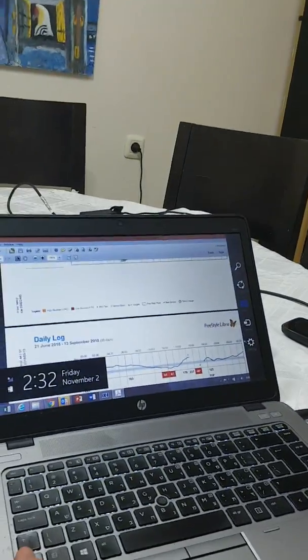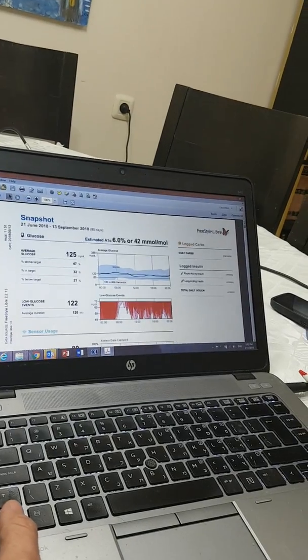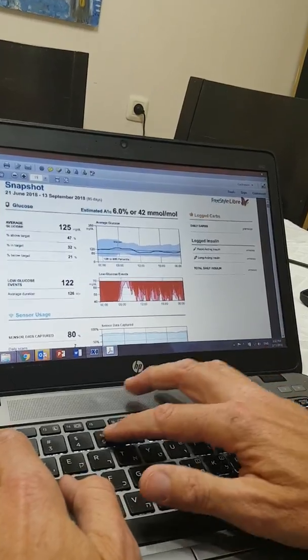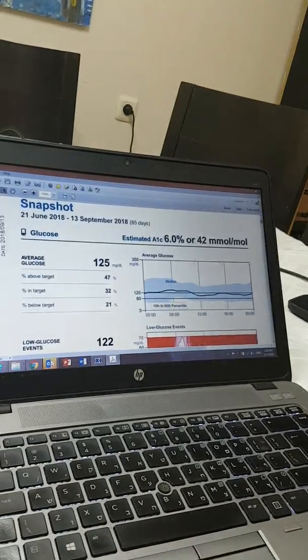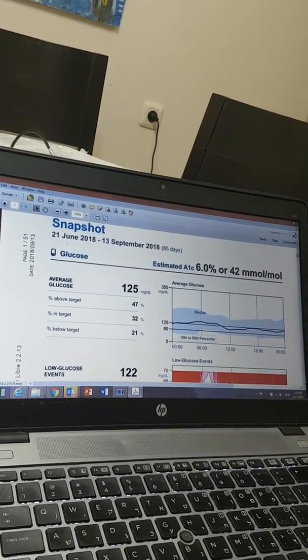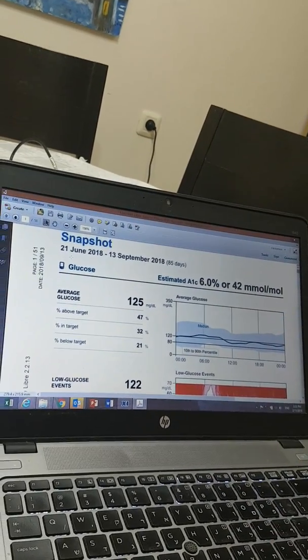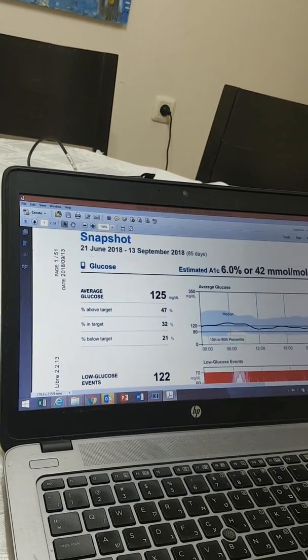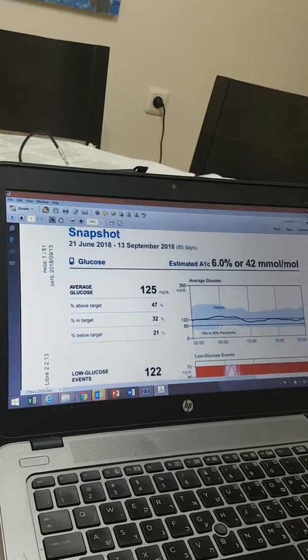I was very upset. If you look at the Freestyle software — and I'll make it maybe 150% so it's a bit easier to see — you see here the analysis from the Freestyle download. Between June and September, they show an estimated hemoglobin A1c of 6.0, when in reality, when I measured it in the lab, I had 7.4. I couldn't believe it, so I measured again and got 7.3.